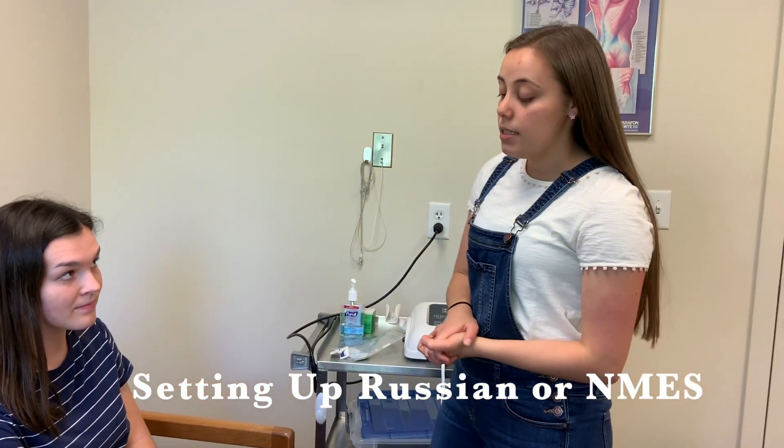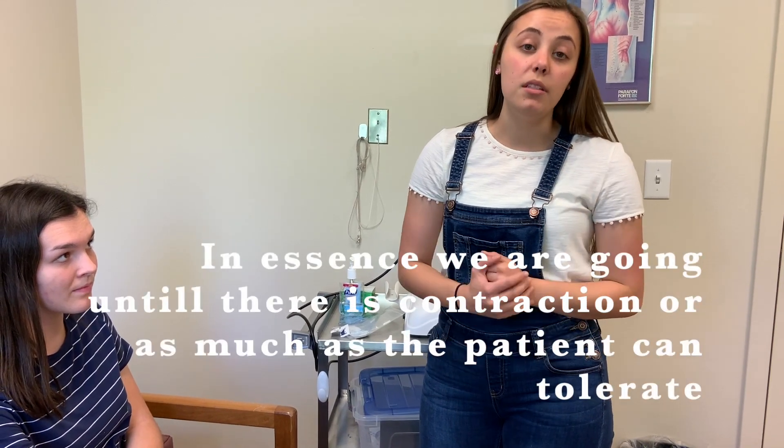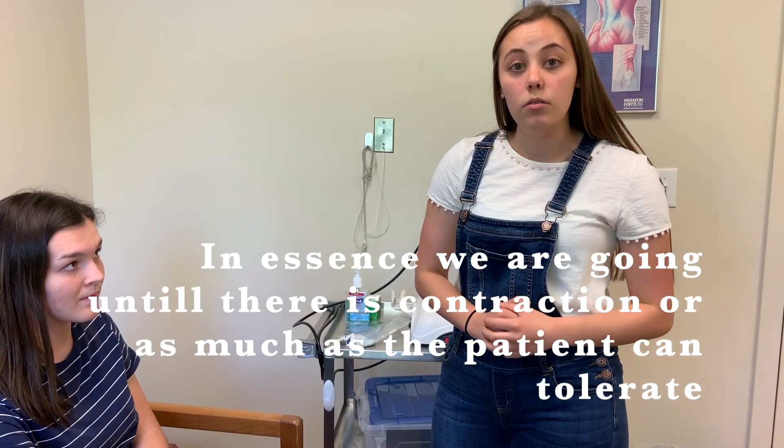One important thing to emphasize to the patient when doing Russian is that we do want an actual contraction, and it most likely will be a little bit uncomfortable — but we still do not want pain. If it is pain, then we need to adjust the treatment somehow, or not do it, so it's not pain.